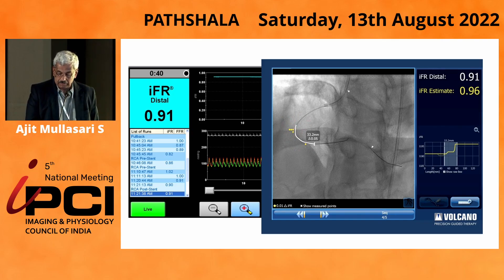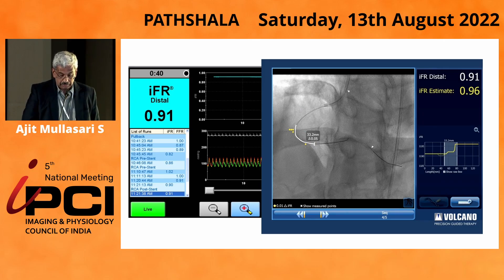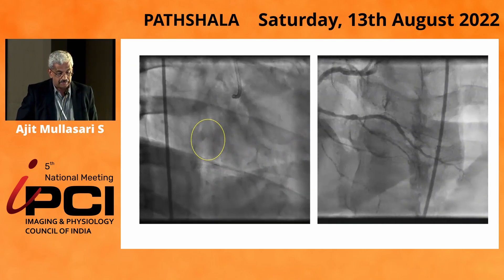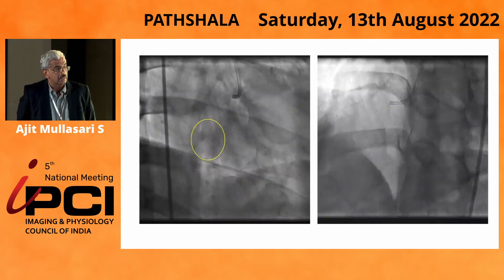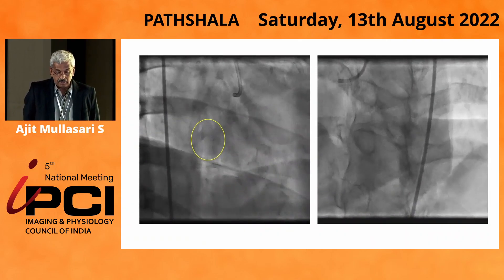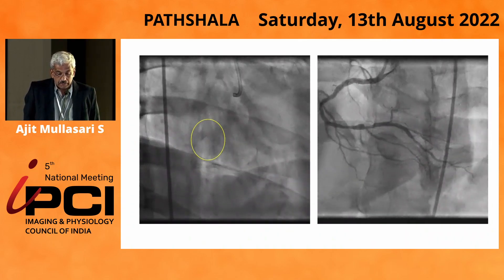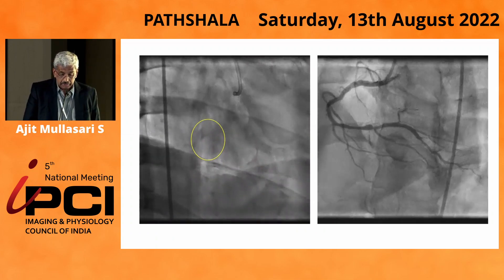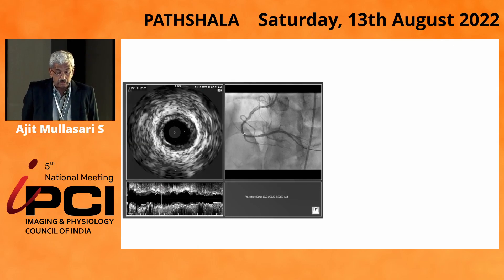You can see clearly, if you look at the points, if you want to get an estimated IFR, it's exactly 4 here and 1 here. So we need to realize that this is because of the dissection. You can clearly see on the angiogram now in the RAO view there's a flap there, and there is an issue in the middle of the RCA. So clearly we are now looking at how to fix that.